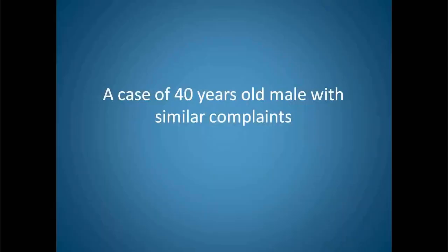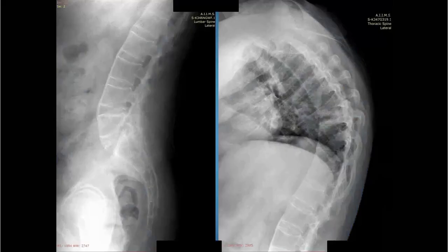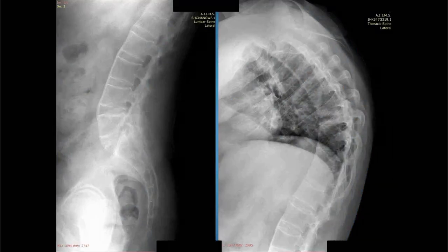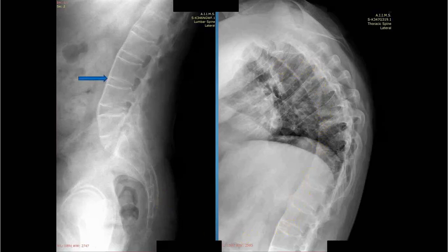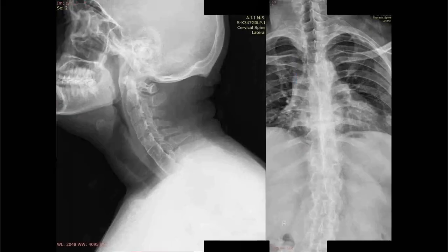Here is a similar case of a 40-year-old male with similar complaints. We can see a similar kyphotic deformity involving the dorsal spine and presence of multiple syndesmophytes bridging across the vertebral bodies. This is the cervical spine radiograph of the same patient showing syndesmophytes again bridging across the vertebral bodies, and in the dorsal spine we can see the dagger sign.